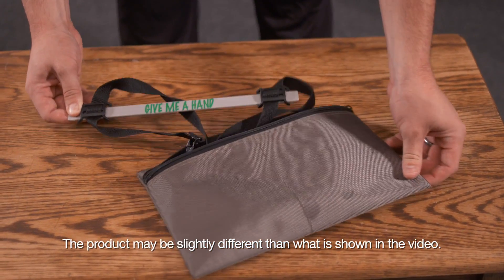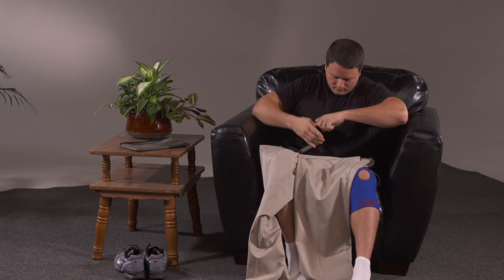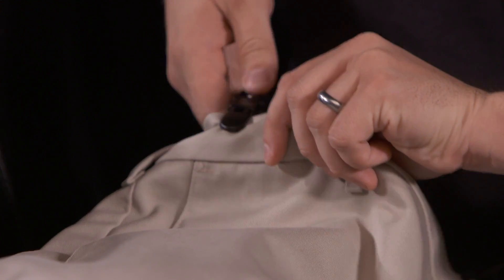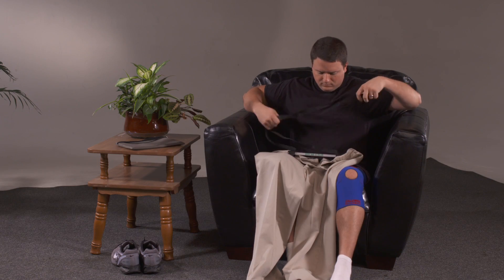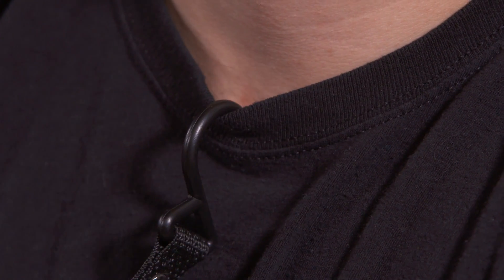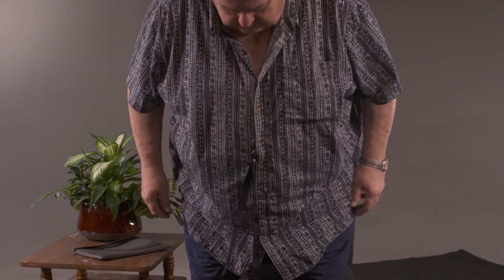Give Me A Hand comes fully assembled in a compact storage pouch. To use it, attach the tight gripping clips to the waistband of the garment, then attach the hook to an upper body garment — for example, along the button line or neckline of a shirt. This allows you to release the straps at any time without them dropping out of reach.